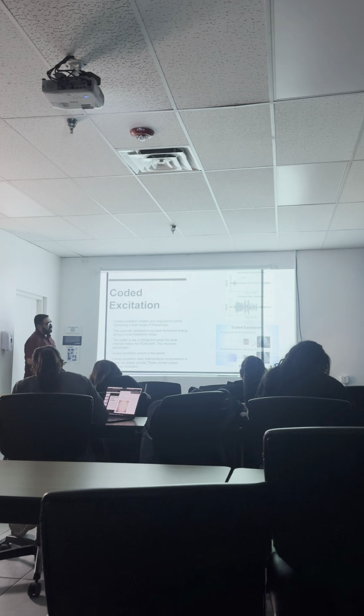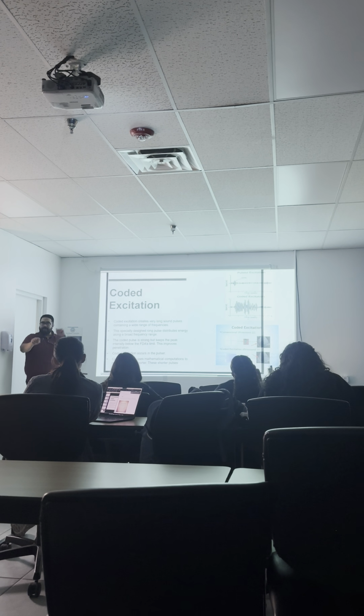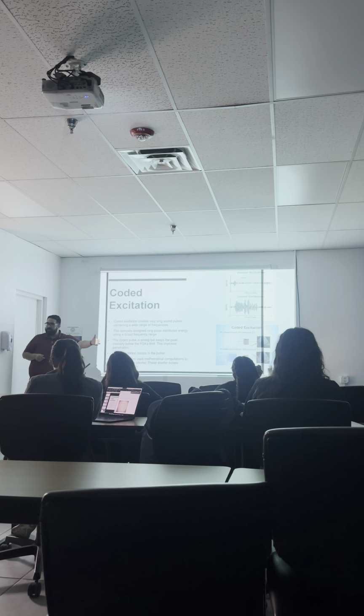So it's just going to send out this part of the pulse instead of sending out the whole pulse. Or it's going to be superficial and we're doing the carotid and it's going to send out a shorter pulse because the frequency needs to be higher to make it look better, right? Okay, so this can be manipulated mathematically by the machine. It'll pick and choose which frequencies it wants depending on where we're aiming. But what it does is it helps the pulse travel deeper into the body.